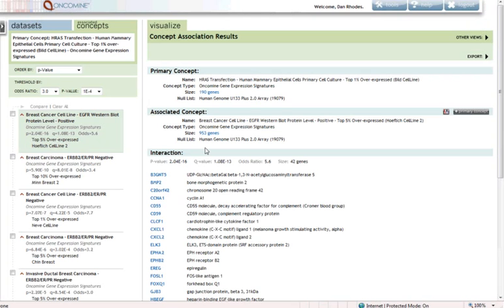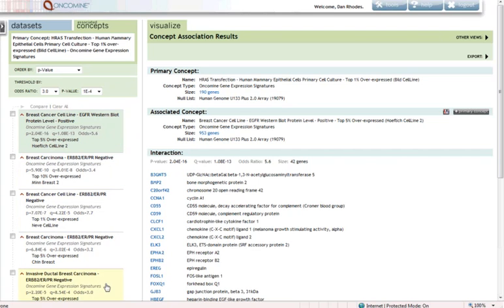Let's click on the 5 here and learn about breast cancer molecular subtypes that overexpress the RAS pathway. Our first hit here is with breast cancers that are positive for EGFR by Western blot. And that makes sense, that EGFR-positive breast cancers would overexpress the RAS pathway. Our next four associations here are all from independent studies, and these are all triple negative breast cancer signatures. So ERBB2, ER, and PR-negative breast cancers overexpressing the RAS pathway.